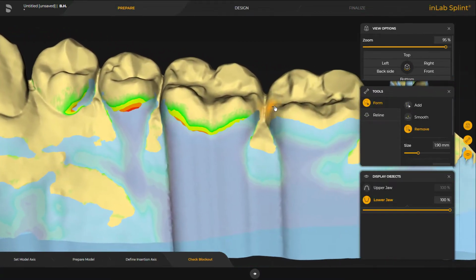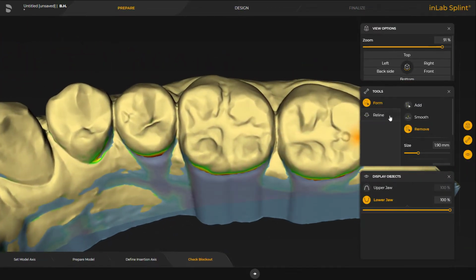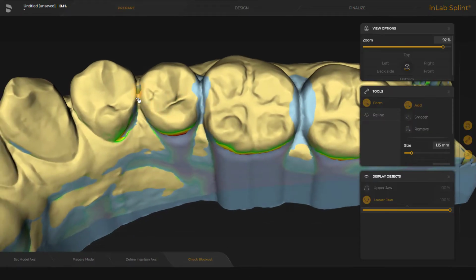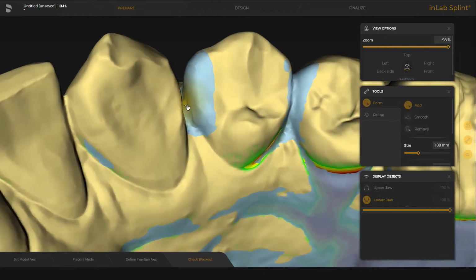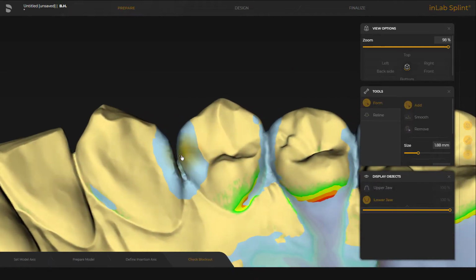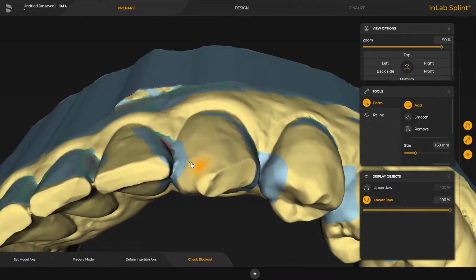I will leave the interdental area with a blocked out area. That makes it more comfortable to wear it. This is very important, especially in the anterior region. And if you have teeth like here, where we have no approximal contact, I would advise you to increase the blocked out area until it touches itself. So it makes it easier for the patient to insert the splint.